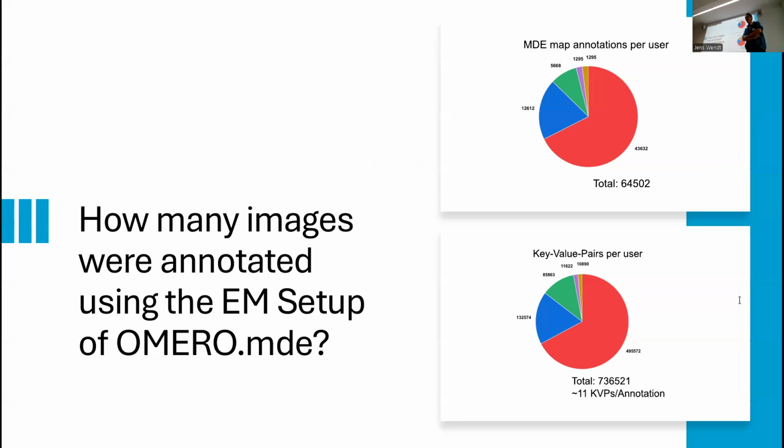So in principle, all of that. One major motivation behind this was, according to our original plan, that our colleagues upload and annotate the data, and then share it via OMERO with our users. In our reasoning, that would have the big advantage that our users get high quality annotated data, and get annotated data in OMERO at all. So that in a second step, the users can also realize how beneficial it is to have this metadata in OMERO, so that the search in OMERO works better for them. I know my colleagues in the imaging facility now make use of this when they are searching images in OMERO, and are realizing that it really makes sense to add this metadata.